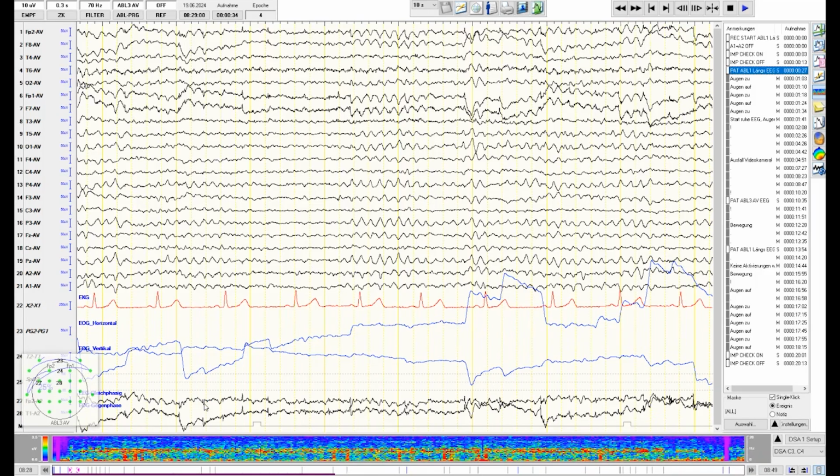And before starting that, they decided to do, of course, an EEG, as I told you. And what they saw is the following. To the left side of the EEG, I hope you can see my screen now, you always see these numbers and letters, which describe the channels, like in the ECG. It's very easy in EEG because the odd numbers, like T3, are on the left side, and the even numbers are on the right side. F is frontal, O is occipital, T is temporal, C is central, and P is parietal. If you know the anatomy and remember your courses during your studies, you will be able to read where this electrode is located.